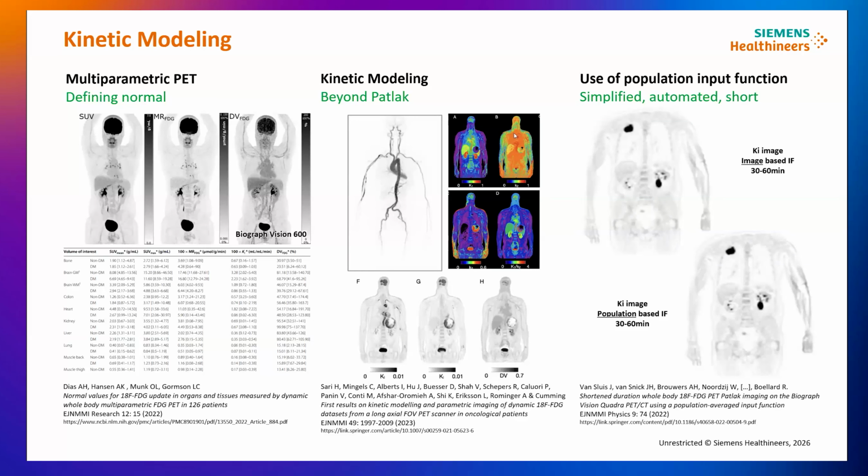If you're able to automate the full multi-parametric PET and basically reduce the whole arduous process of blood sampling, dynamic acquisition, denoising, and implementing kinetic models into different platforms, into a one-stop shop, ideally by pressing only one button, and also reduce the demand from 1 hour scans to something like 20 minutes, which is available today with a population-based input function, having all the organs within the same field of view, it basically makes this very easy for academic research, for clinical use, but also, as importantly, for drug development.